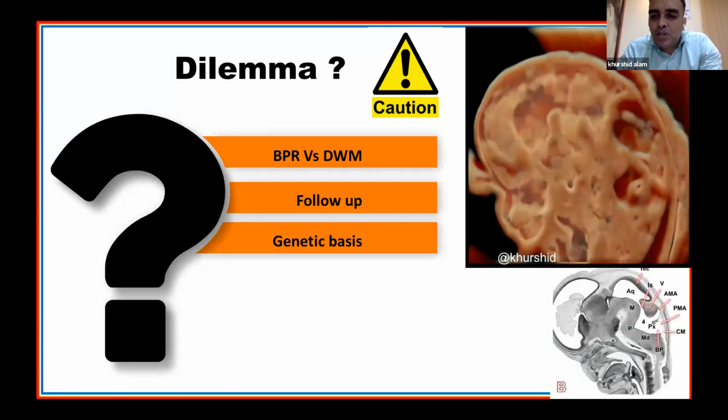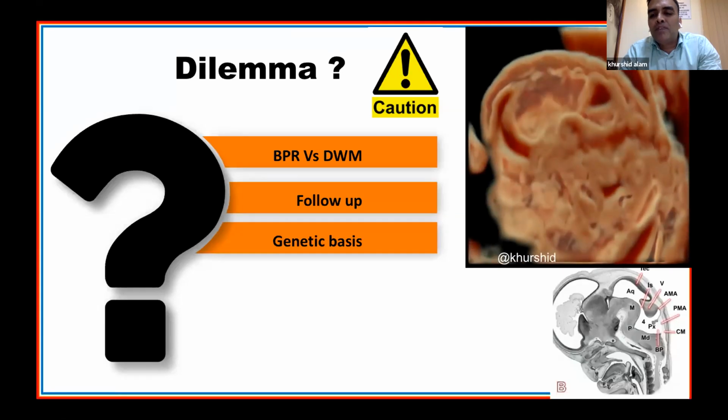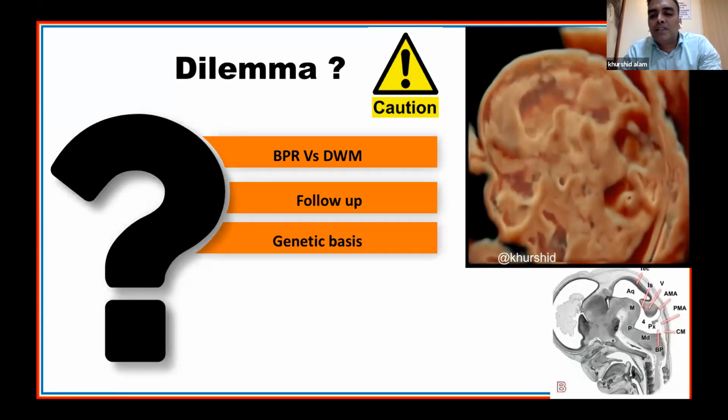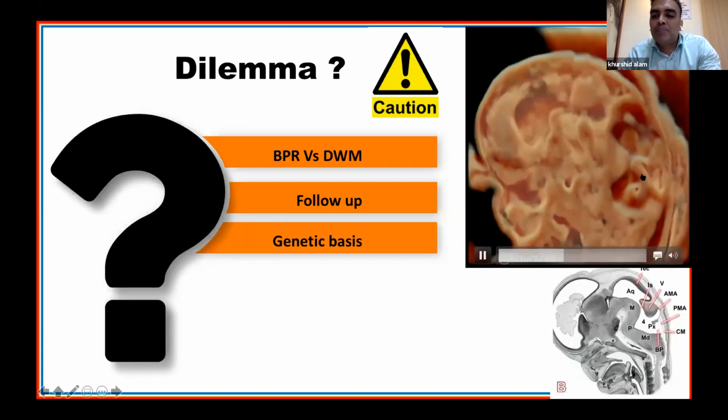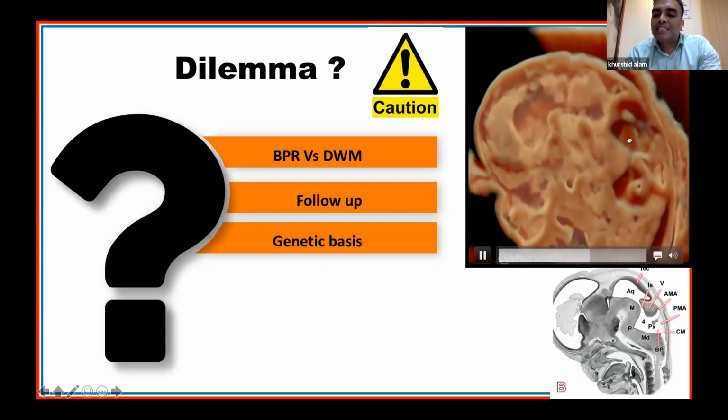Now, as I remember, Dr. TLN Praveen sir always says, whenever you are examining the posterior fossa, it's incomplete without evaluation of the aqueduct of Sylvius and the brainstem. Henceforth, as you can see in this embryological specimen, the same thing can be correlated here in the 3D image, where you can see the isthmus, the aqueduct of Sylvius, and then the fourth ventricle, the choroid plexus, the fourth ventricle, vermis, all the anatomy is very well delineated.